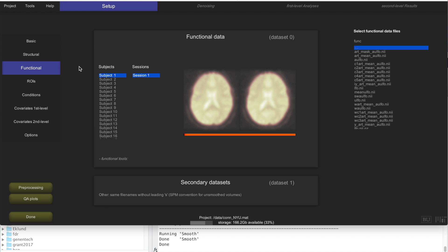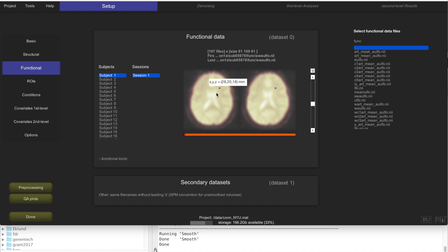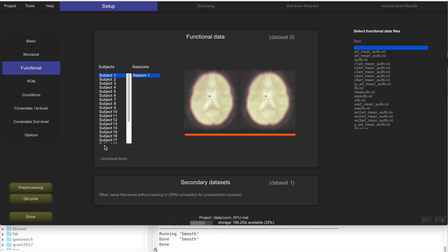Now we're going to look at the results of these preprocessing steps, just make sure that everything looks fine, and how to evaluate that, and then we're going to move on to denoising. This is the functional data — it looks a little bit blurry, because it has been spatially smoothed.